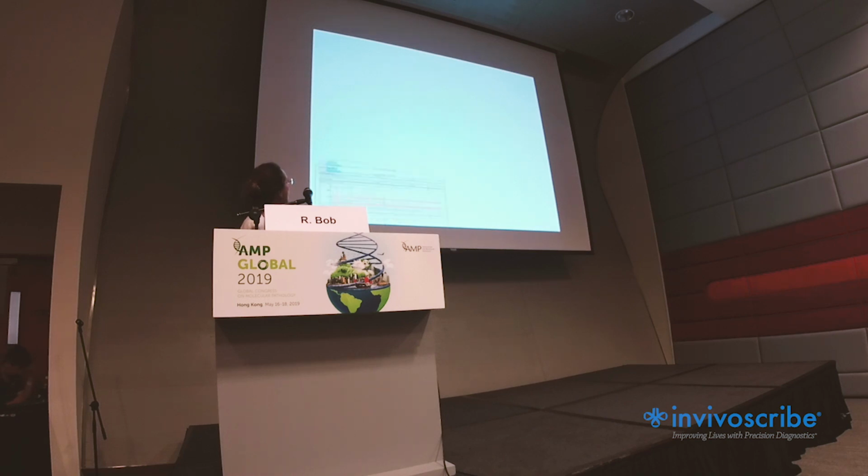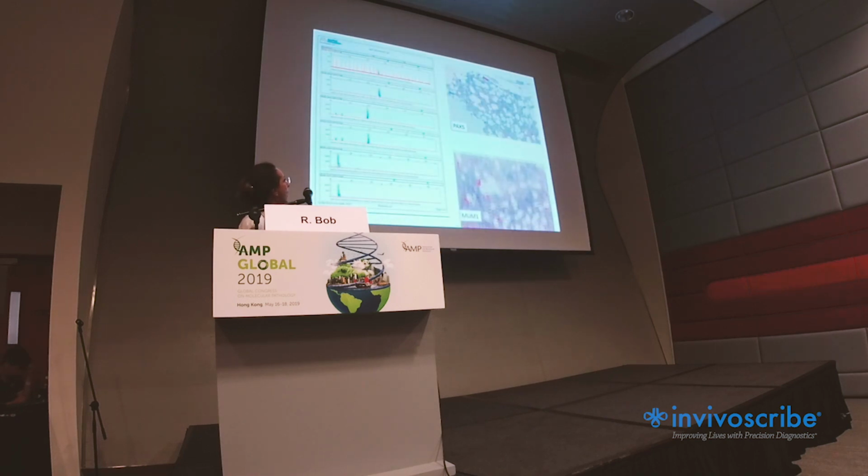So now I look at my results in another way. What we see is that the larger peak is representative of these plasma cells, which are representative of an MGUS. And the smaller peak is representative of these B cells, which actually is representative of the monoclonal B lymphocytosis.